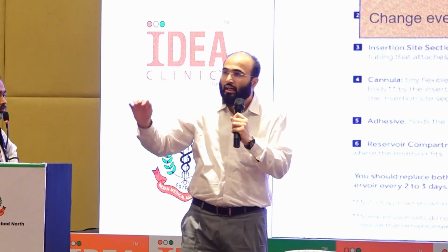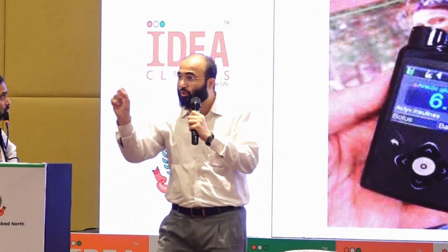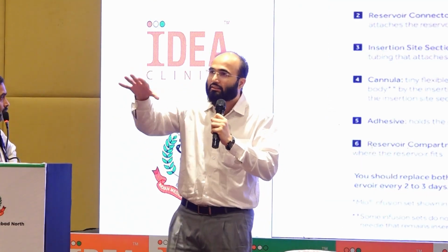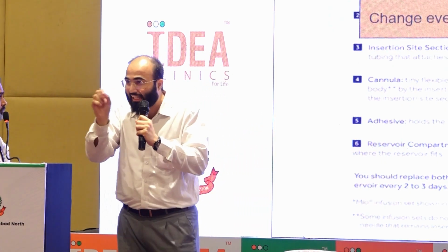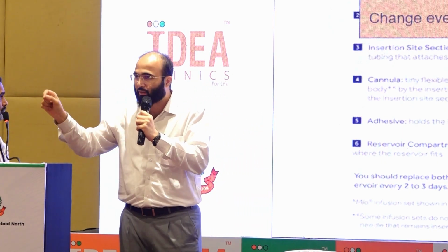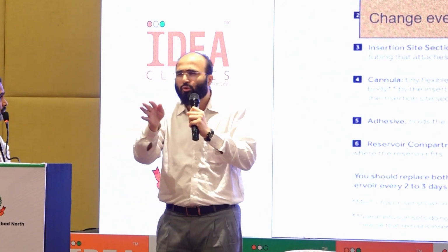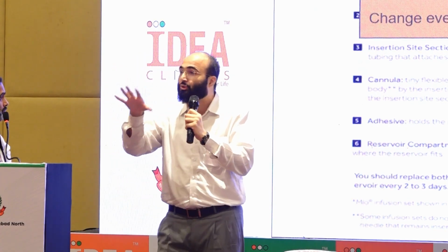I hope in CGM you are aware, there are some arrows with each number. Say it is showing 136 milligram per deciliter as your current sugar level. It has an arrow mark along with that number. If the arrow is pointing towards your right, it is almost stable, no significant change in sugar levels.